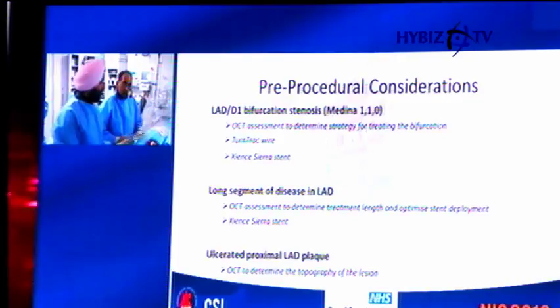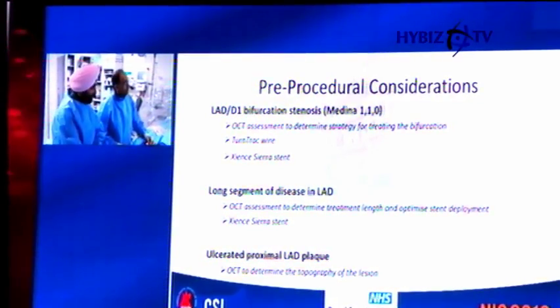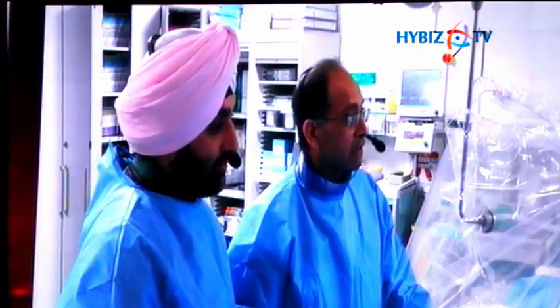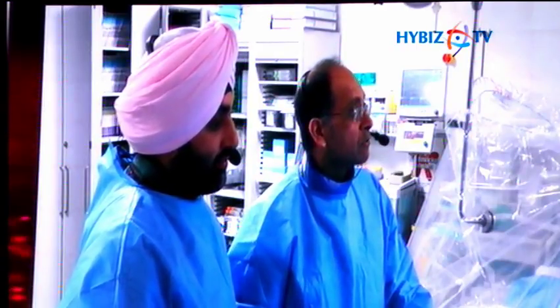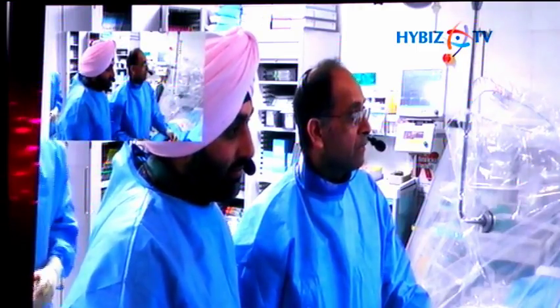So if we come to Devon now, we can take you through some of the pictures that we've already taken. Okay, so if you can have the films after the last image you showed, Peter, showing there's quite a calcified lesion. Should run number 8, please, thank you. That's it, show that. And that shows there's quite a hard lesion, high pressure required up to 12, 14 bar, just to get the OCT done first.